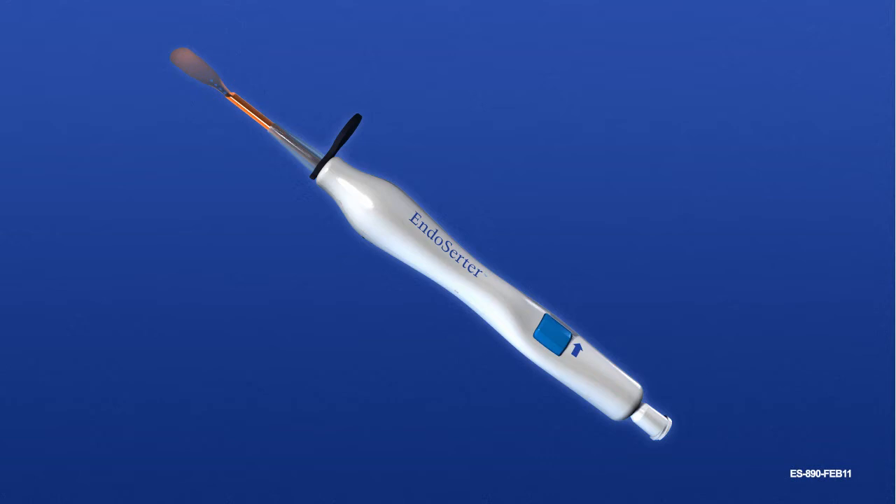The device is delivered with the amber-colored allograft carrier already extended in the loading position. Hold the device so the side printed with Endosurter faces up.